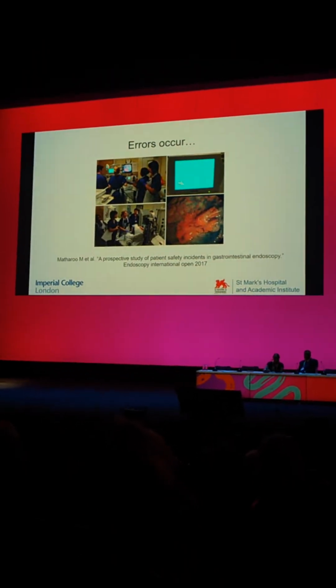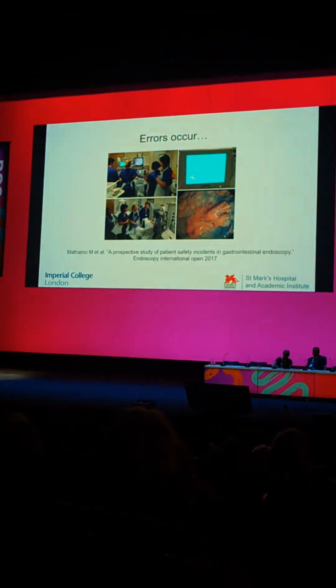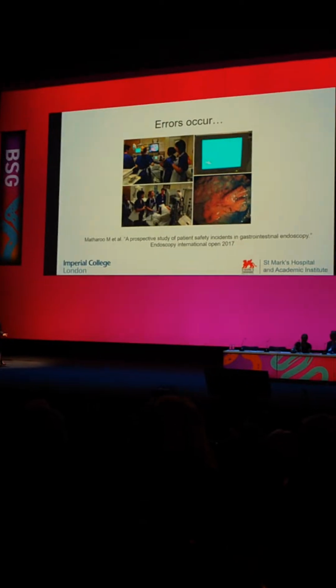So what about endoscopy errors? Why are we worried about this? Well, we know from our prospective observational studies that errors are common and they occur frequently. And in this study where we looked at 140 procedures, we actually counted 140 errors.